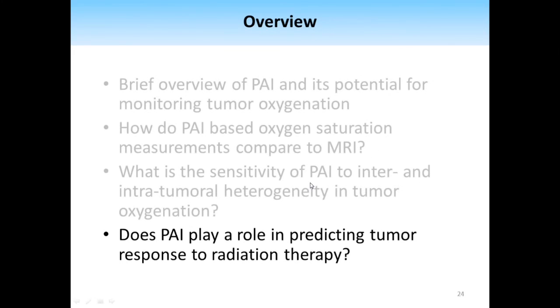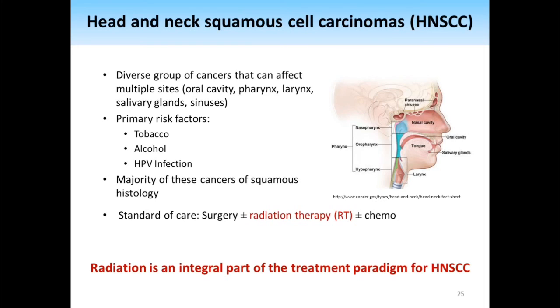And this is getting into the overall goal of what my research is looking at. Now that we have validated the oxygen saturation levels with these two MRI techniques, can we use these measurements to predict tumor response to therapy, and specifically radiation therapy, which is what we're interested in. And as in my background, as Christina suggested, we are focused on head and neck cancers.